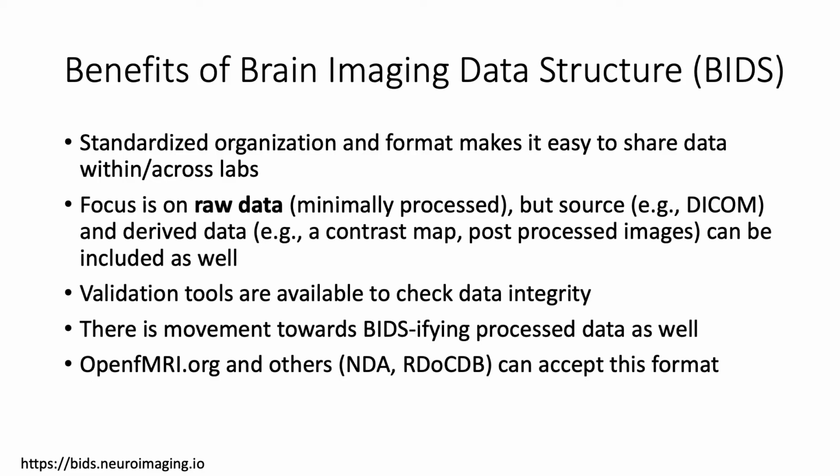And although it's still early on, they're working towards this standard of BIDSifying, if you will, processed data. Because if you've used, say, FreeSurfer, they have one way of organizing their output. But then if you use SPM or FSL, they have other methods. And so how do we understand what we're looking at, right?